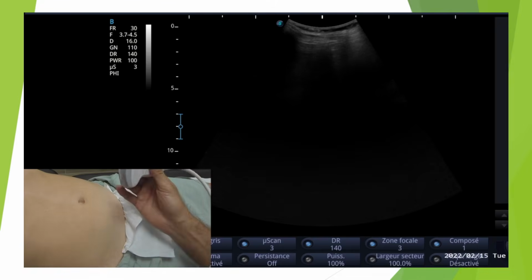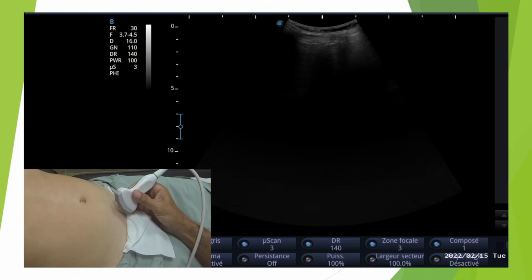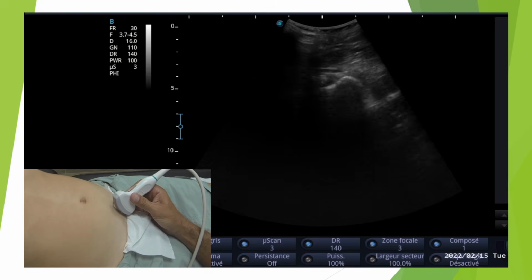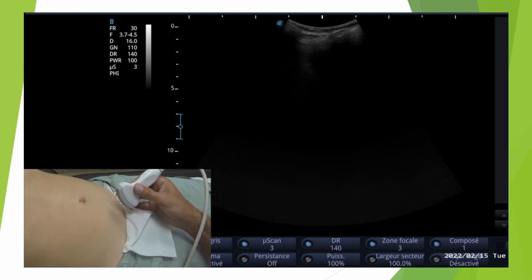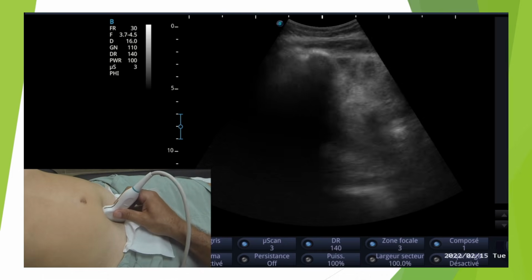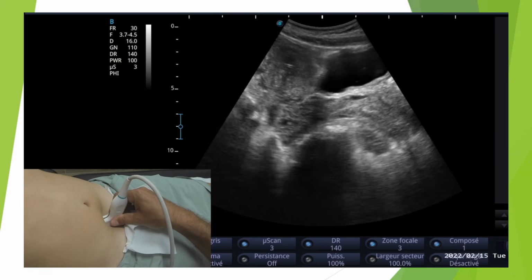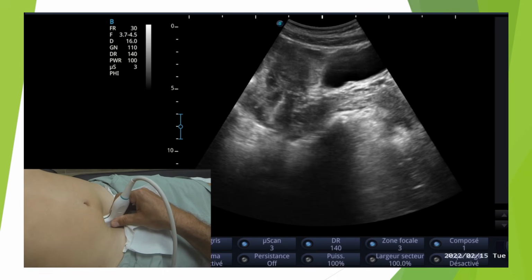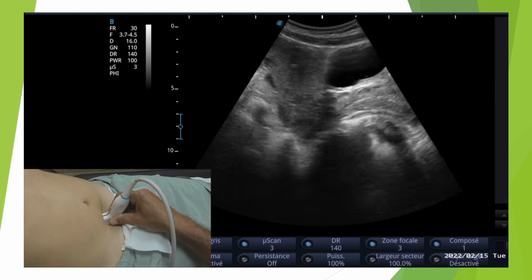So we're going to check the positioning of an IUD in this patient. She has a hormonal IUD, a Mirena-type, which is definitely harder to see than copper IUDs. We'll start with a sagittal suprapubic scan. Basically, we're going to check the position suprapubically. We're not going to check the IUD's position endocavitarily, but rather suprapubically.